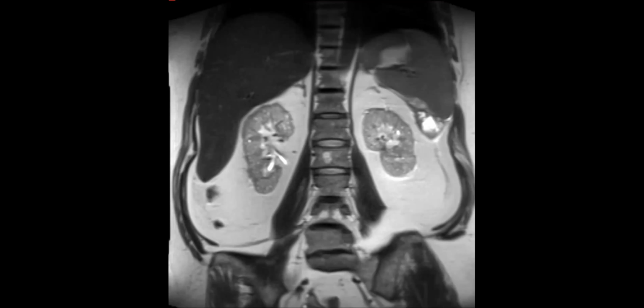Okay. This is an acute finding. So the patient came in with recurrent pancreatitis and had a peripancreatic fluid collection that we've been monitoring. And so we got an MR, and I'm showing you the study to look specifically at the kidneys, incidental findings.